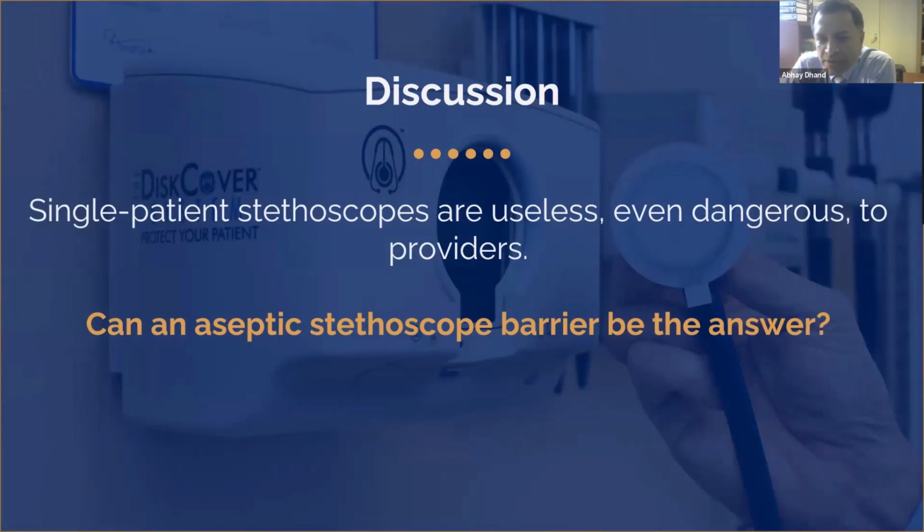One, for all of us who have used the disposable stethoscope, the quality is not very good. So the risk of misdiagnosis is real, and that has been validated in various studies. The same goes for the risk from sharing the stethoscope between the ears, and studies have shown that the contamination rate within the stethoscope that gets passed between the ears of different providers is also there.